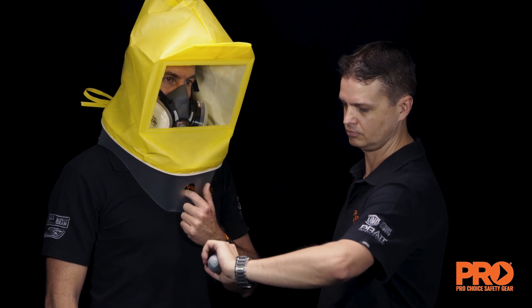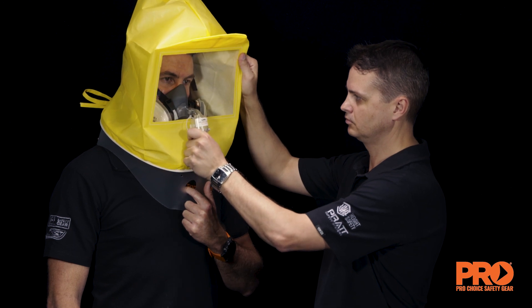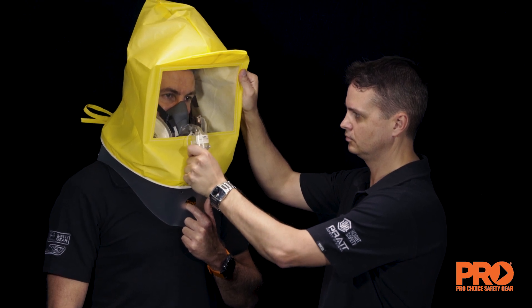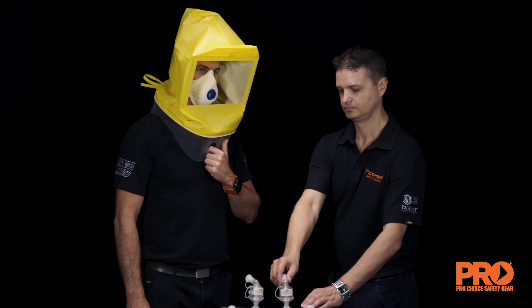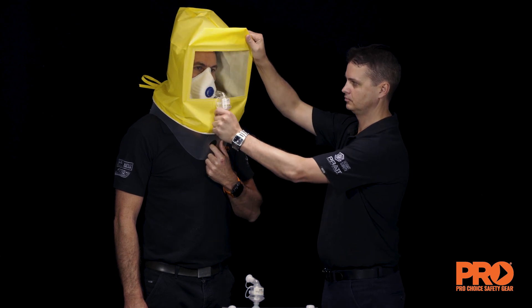The nebuliser must be held in an upright position to ensure aerosol generation. To maintain an adequate concentration of aerosol during the test, following your sensitivity test result, inject half the number of squeezes — 5, 10, or 15 — every 30 seconds for the duration of the fit test procedure. For example, if you tasted the solution in 10 squeezes, then inject 5 every 30 seconds.